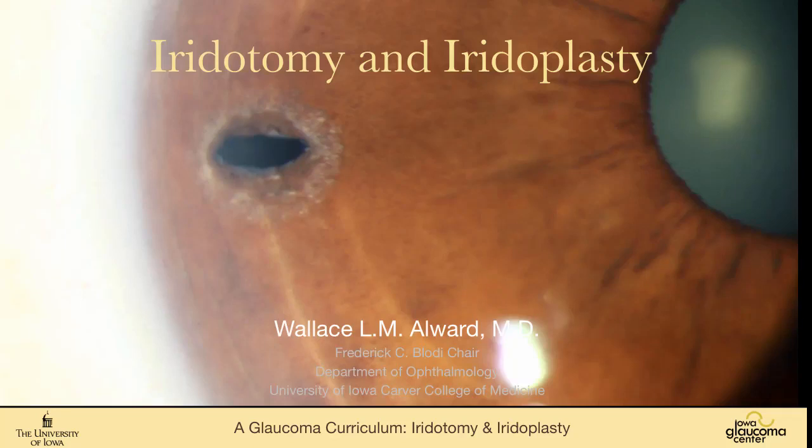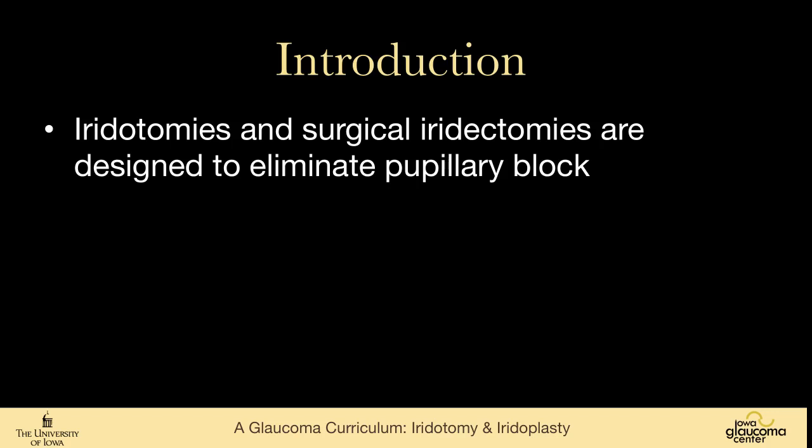We're going to talk about iridotomy and iridoplasty. The laser has been a huge boon to those of us who take care of glaucoma. Iridotomies and rarely surgical iridectomies are designed to eliminate pupillary block.